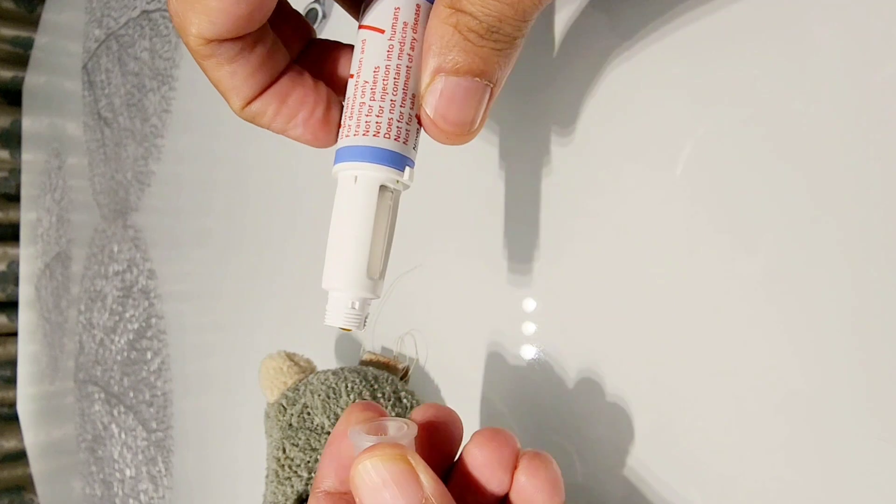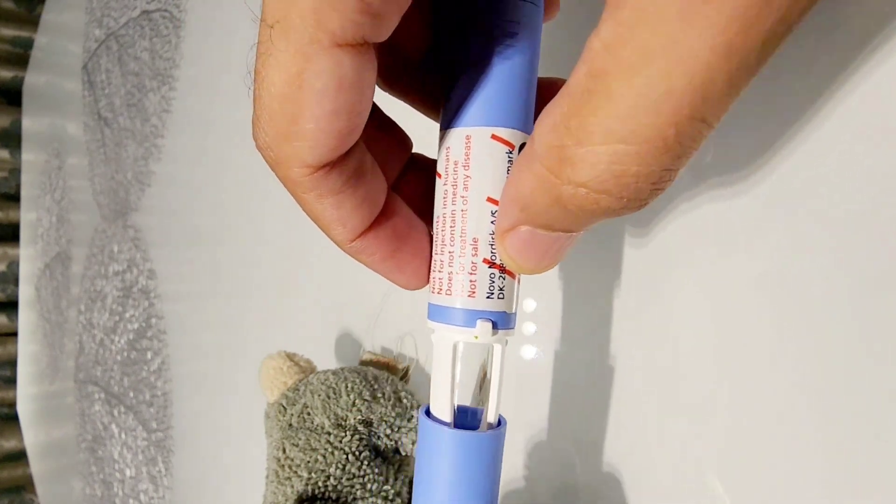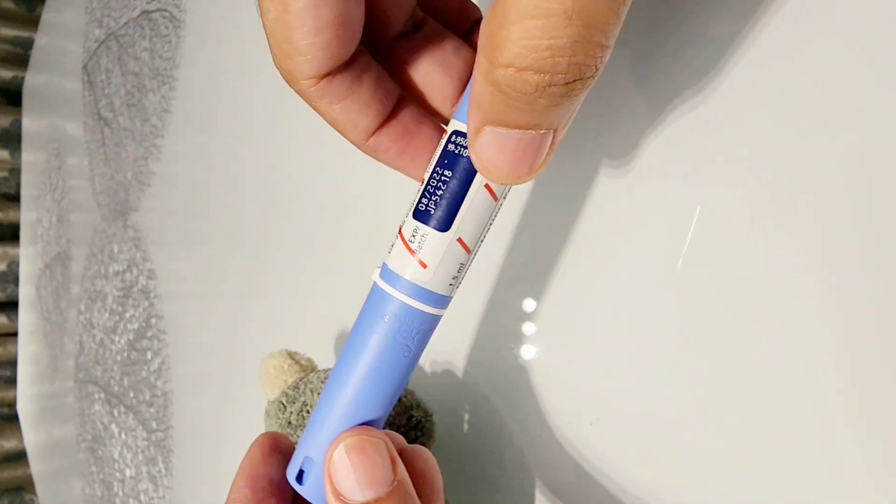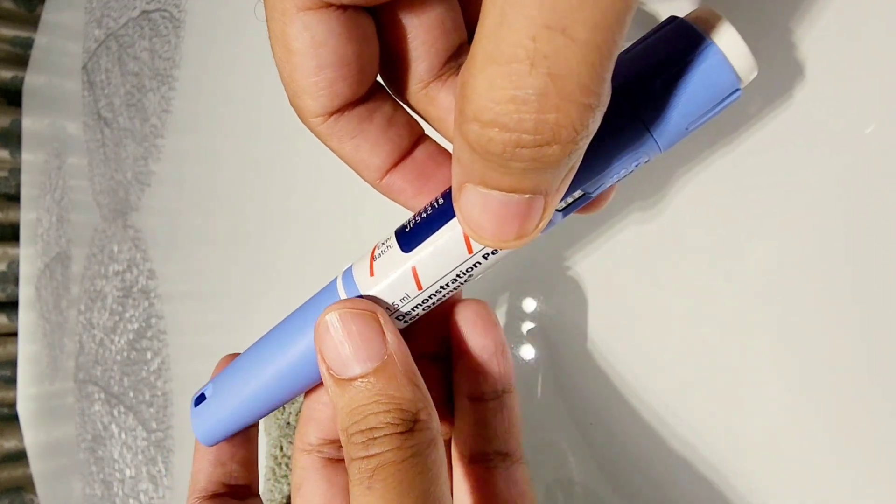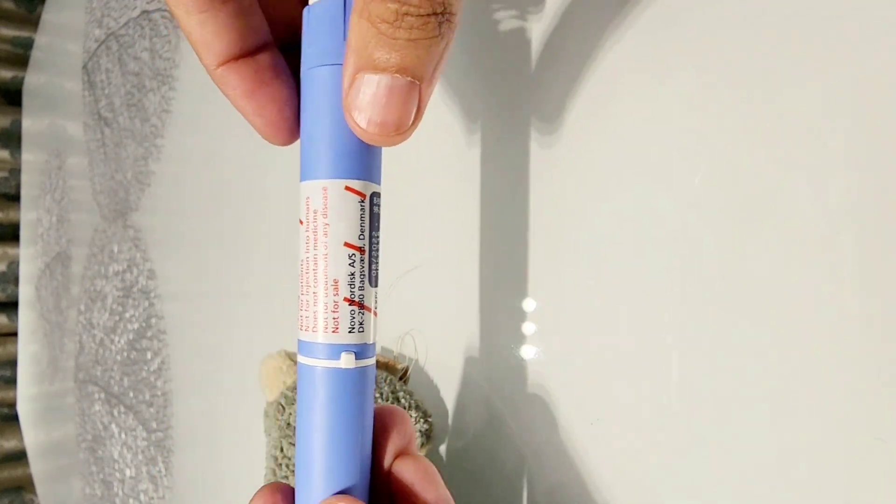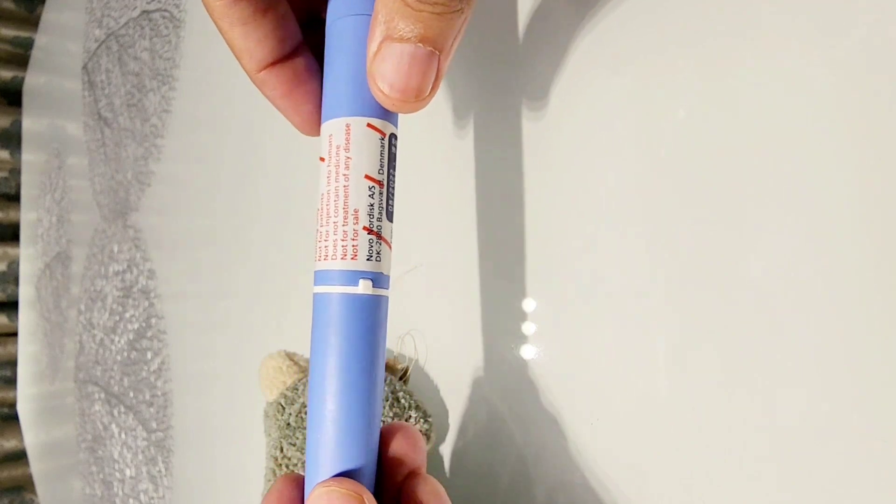Every time you should use a new needle, the pen should be kept in the fridge with a cap on it. Not in the freezer. In the door of your refrigerator so it doesn't get frozen.